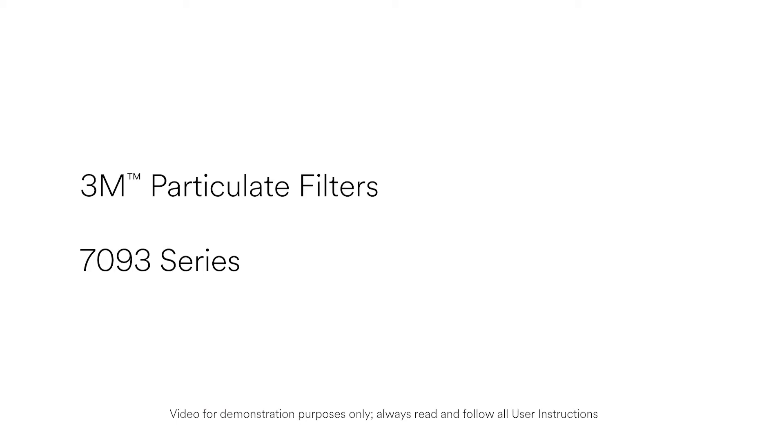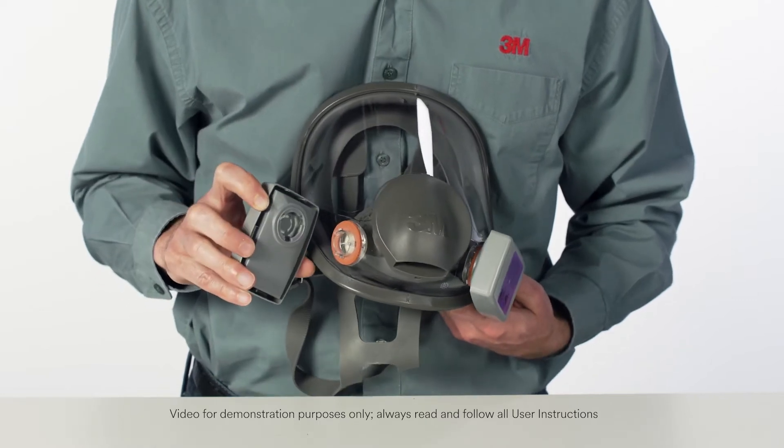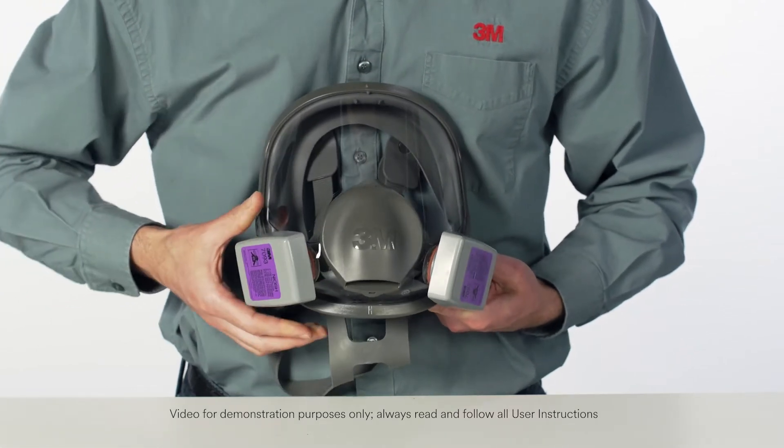When attaching rectangular 3M Particulate Filters 7093 Series, simply align the line on the inside of the filter with the small bayonet lug on the facepiece. Push together and rotate clockwise one quarter turn to stop.